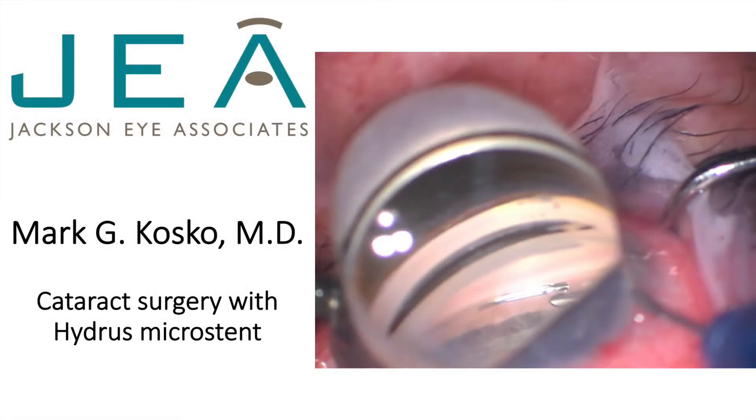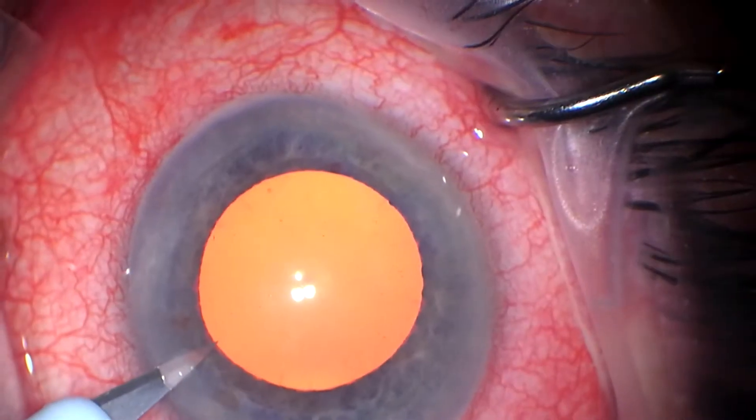Hi, this is Mark Cosco in Jackson, Mississippi. I'd like to share a cataract Hydrus case.